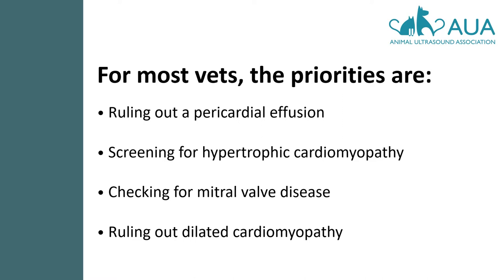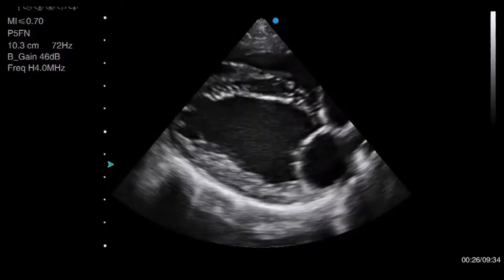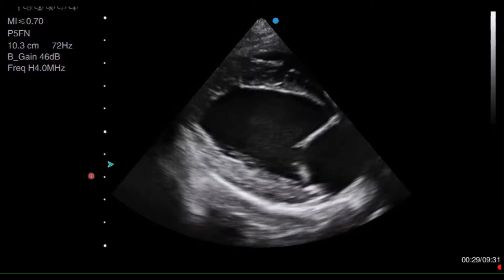I'm going to recap each of those diseases and show you how they appear on ultrasound, but before I do, let's get familiar with normal. The first view I'd like to look at is the right parasternal long axis view. This view is the start of your examination and you can get a good idea of almost everything you want to know just from this one view.